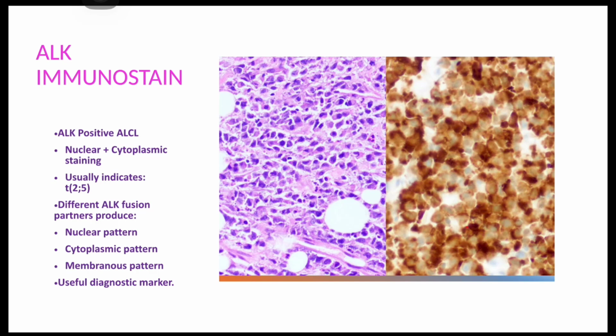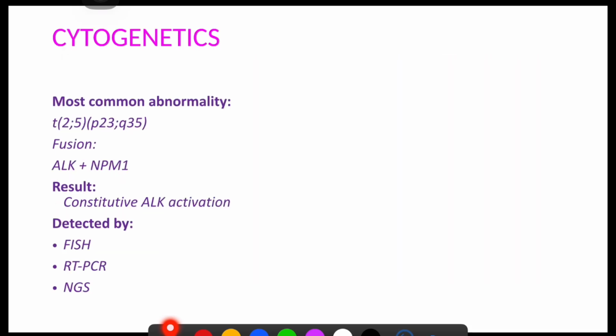Here these are the bizarre cells which are positive, showing nuclear as well as cytoplasmic positivity, and membranous positivity is also there, and it is a useful diagnostic marker.